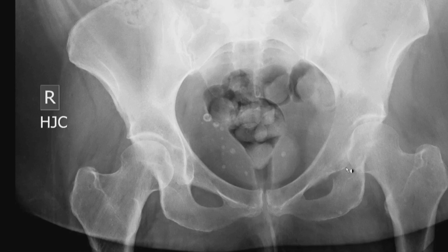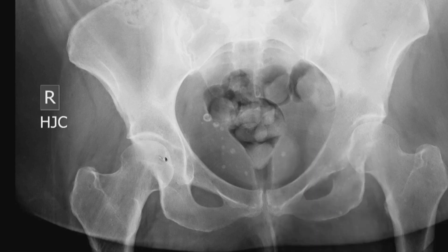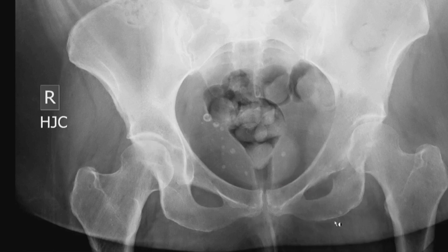The six lines of the acetabulum should be scrutinized on all pelvic radiographs: the anterior wall, the posterior wall, the iliopectineal line, the ilio-ischial line, as well as the acetabular roof and the acetabular teardrop.